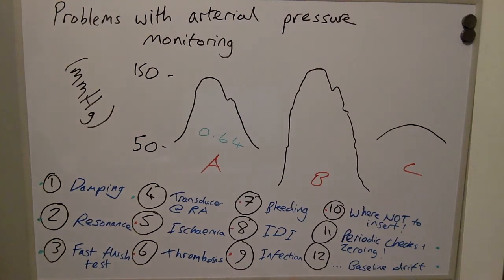In an overdamped system, as we see here, it settles straight back to 0 with no oscillations. And in an underdamped system, here, there'll be oscillation for more than 3 to 4 cycles.